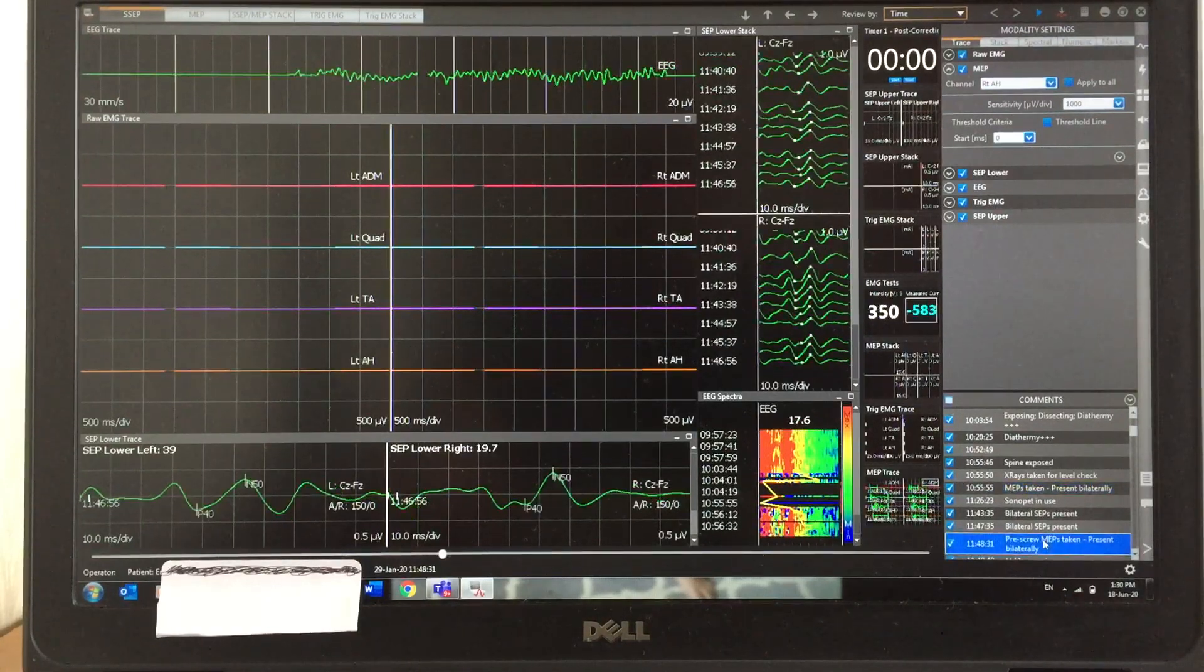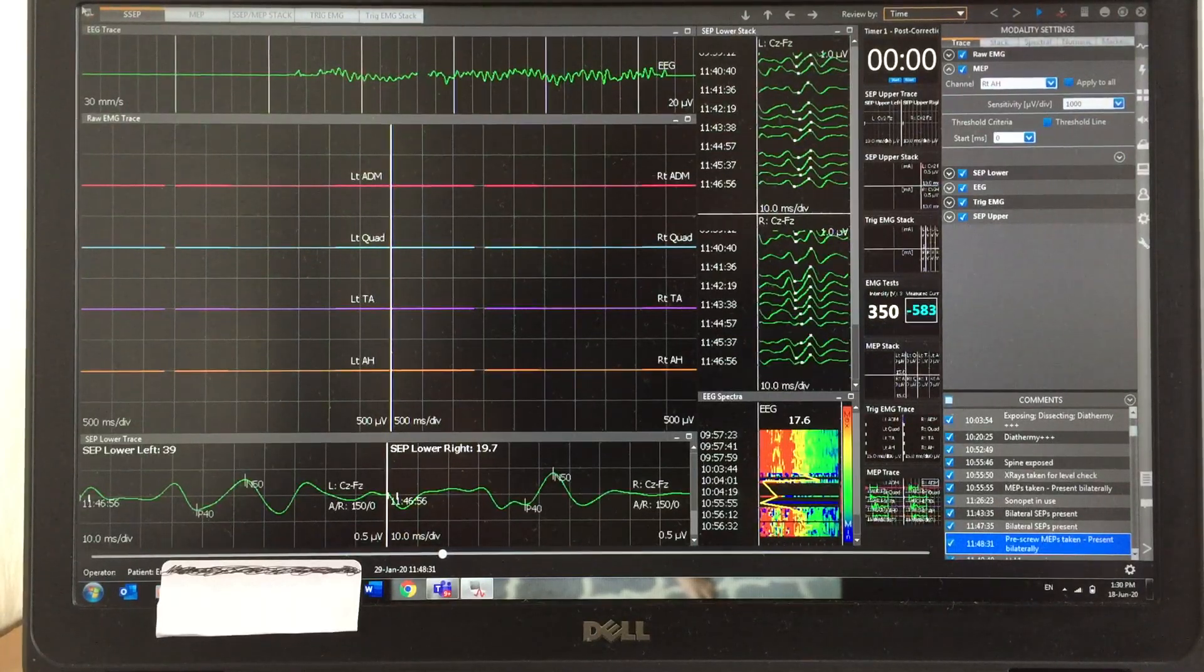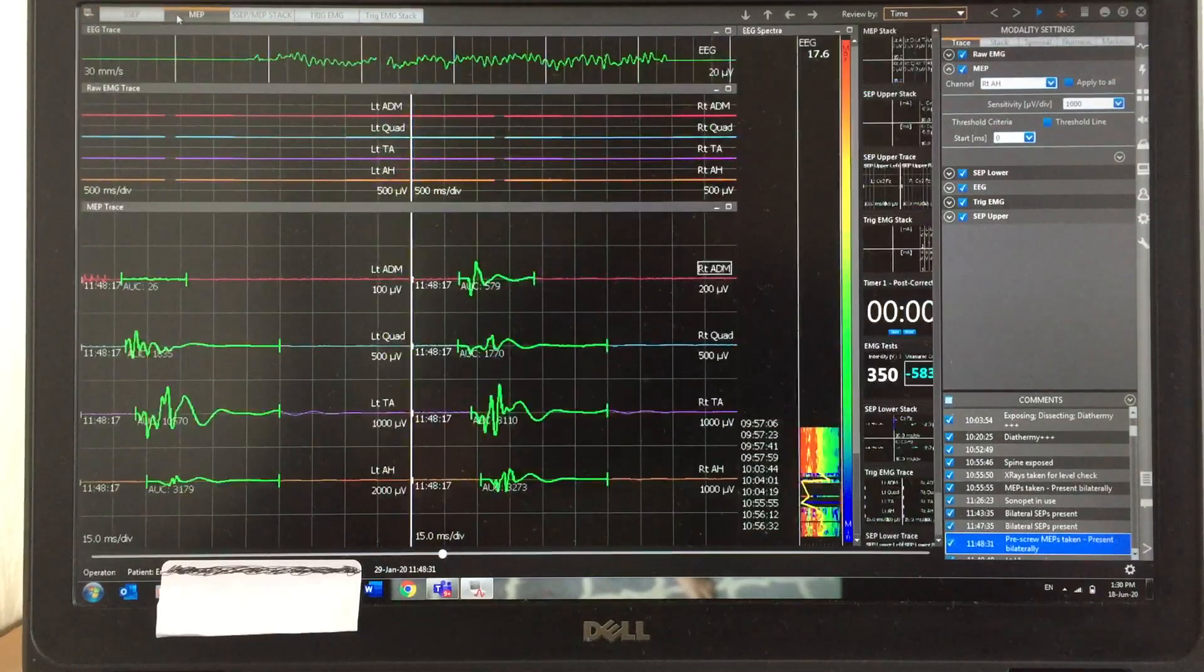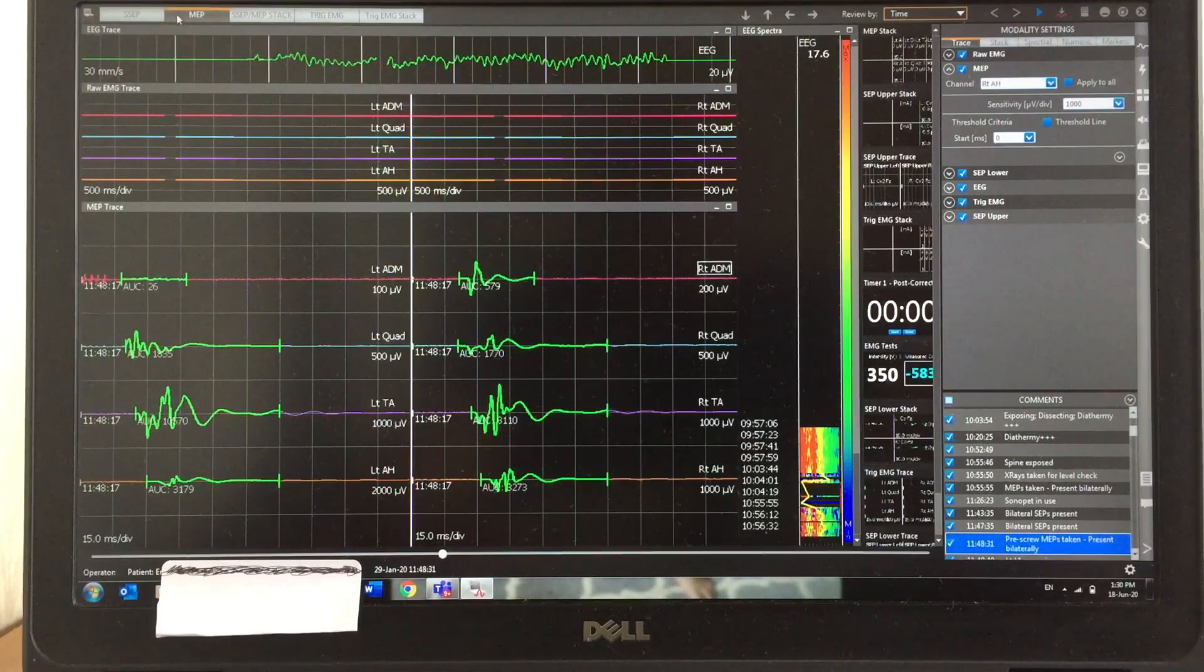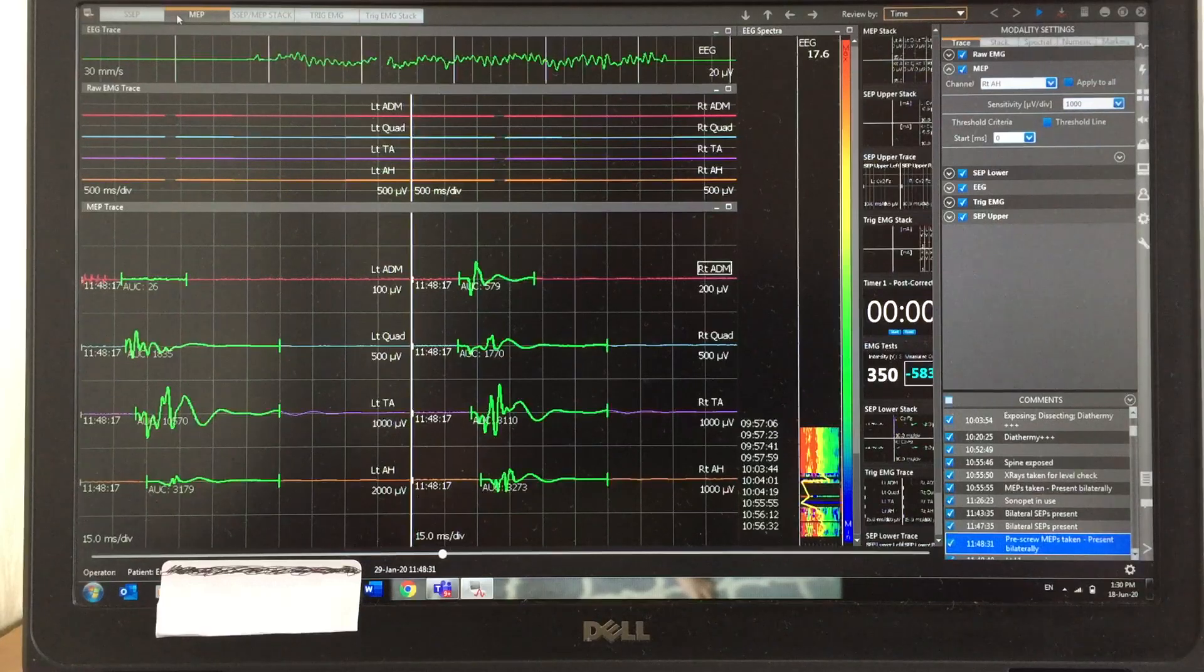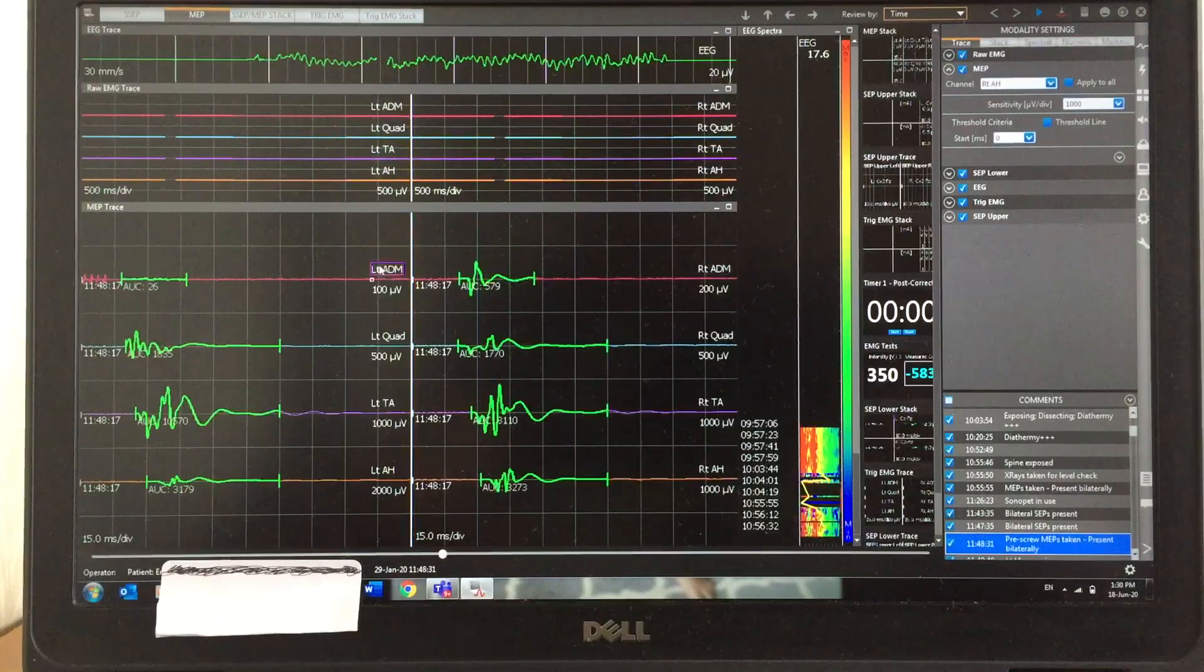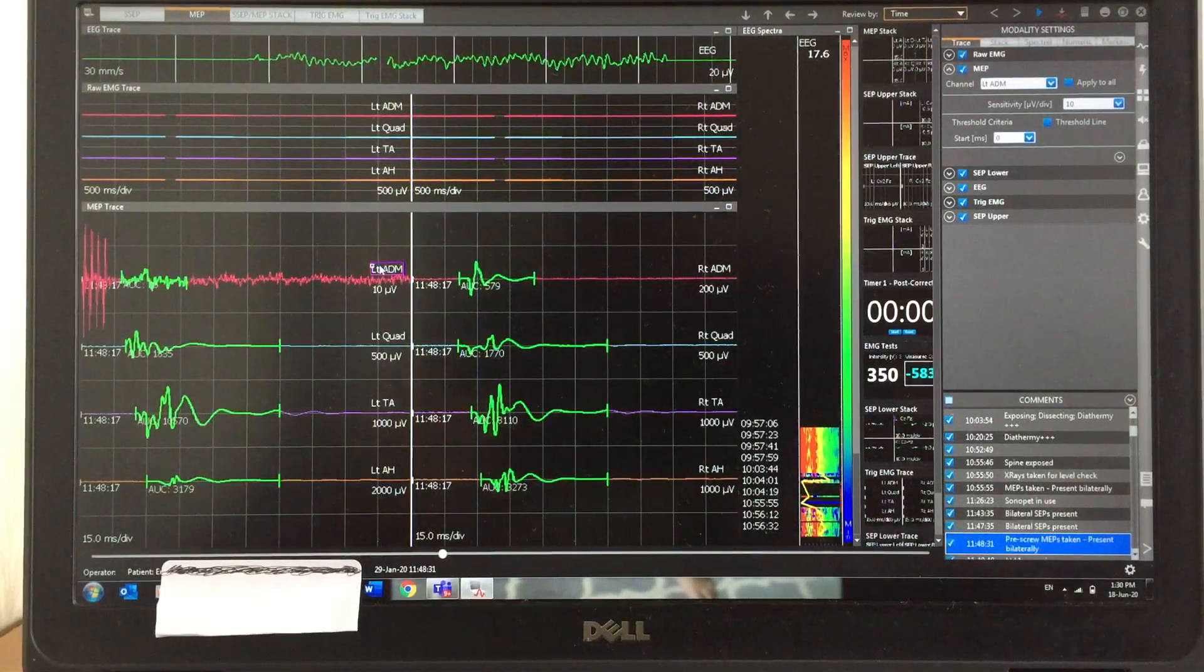This is actually a scoliosis case. I'm recording the MEP responses in different stages. This MEP response is taken before the screws in. You can see not much changes in MEP responses from all the channels.